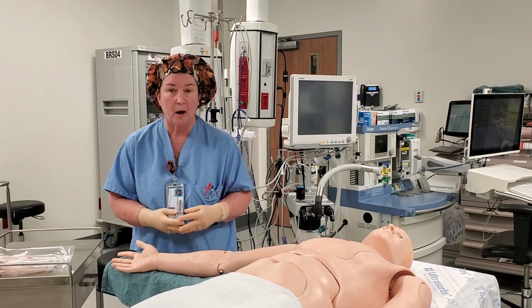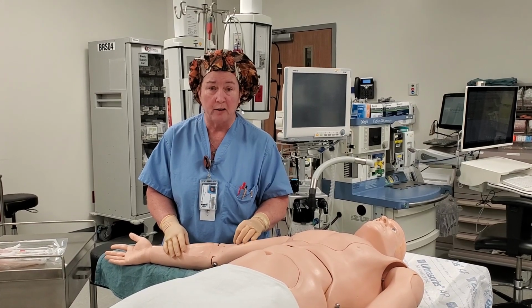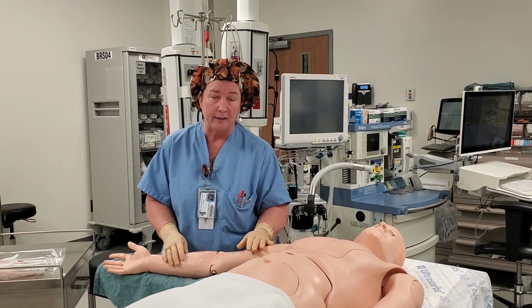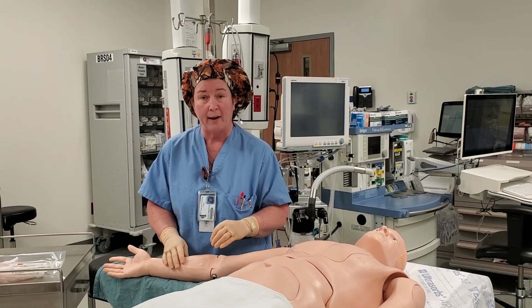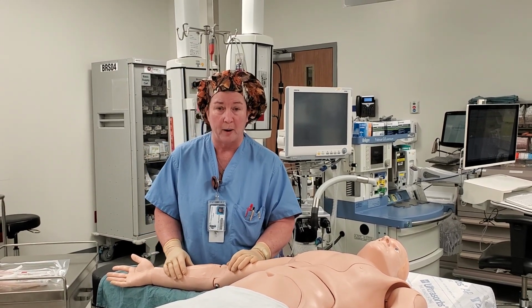So when prepping an upper extremity, you want to take into consideration where the incision site is. And as long as you follow the principles of incision site going out towards the periphery and doing clean to dirty, there's multiple ways to do these preps. Also, whether you have someone holding the extremity or whether you have to hold it yourself depends on how you're going to go about the prep.